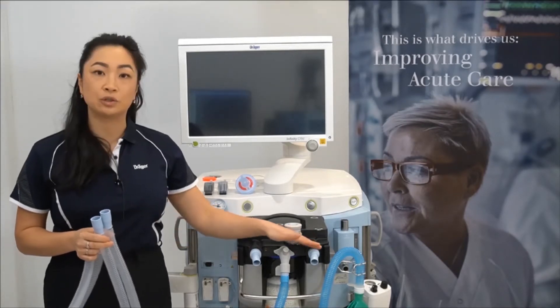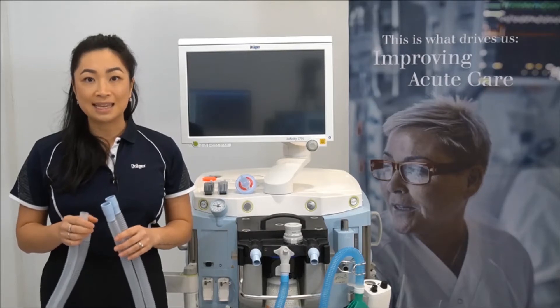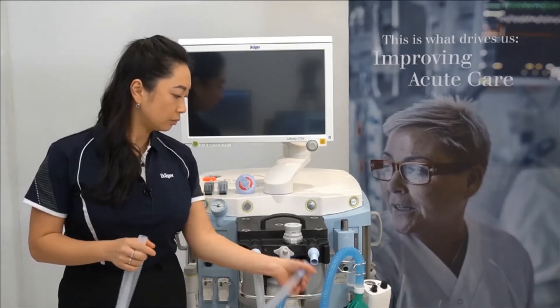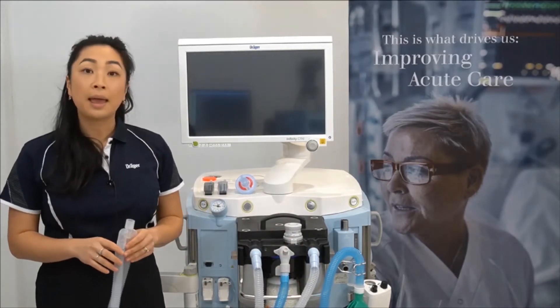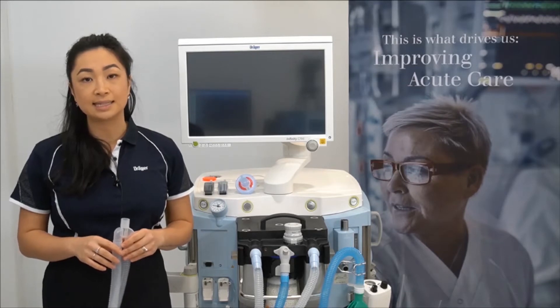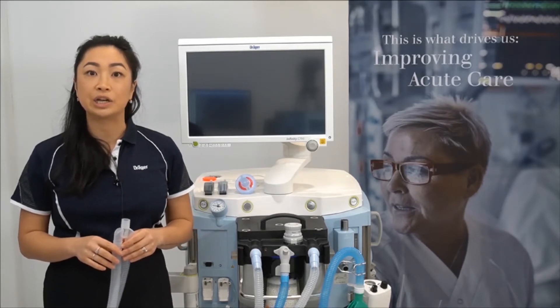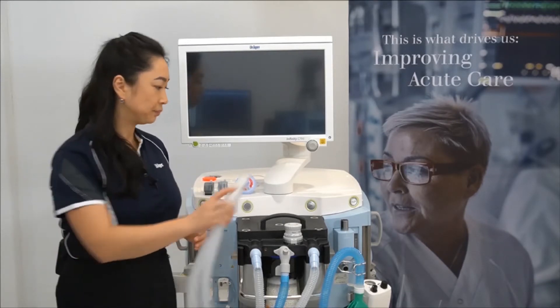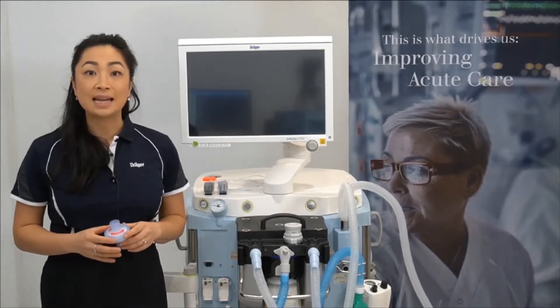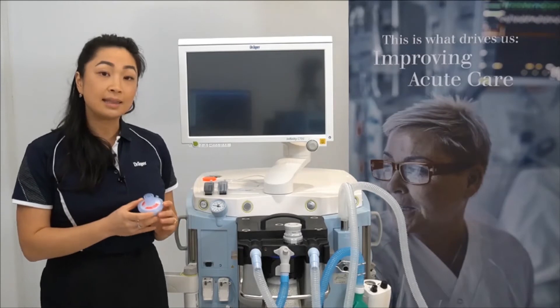Then connect the inspiratory and expiratory limbs of the breathing circuit to the inspiratory and expiratory ports. Note these are interchangeable. Please refer to your hospital guidelines for changing intervals, as this is dependent on the type of breathing circuit being used.